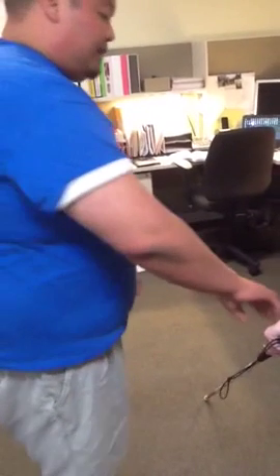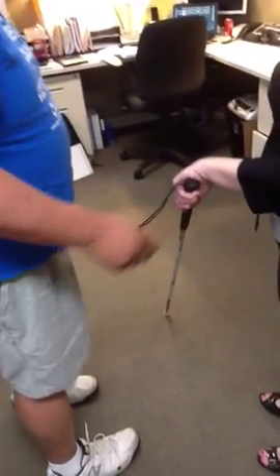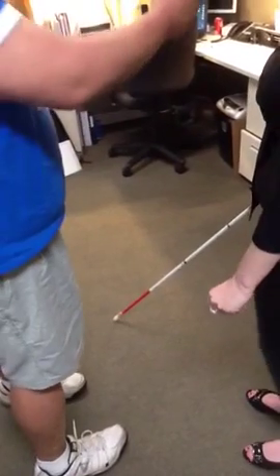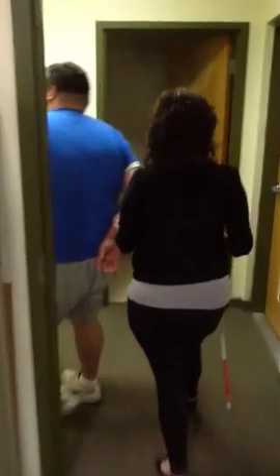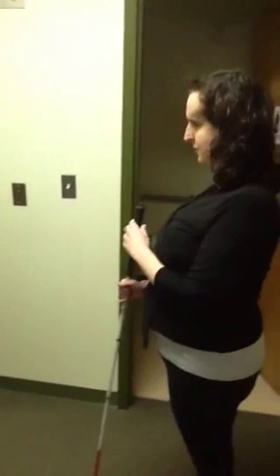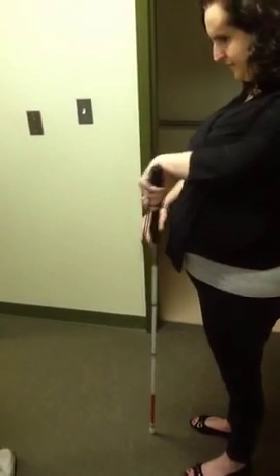Okay? So I'm going to go ahead, if you could hold on to your cane with your other hand, hold it right in the middle of the shaft, like so, it's vertical, like that. This is sighted guide or human guide, and that's how you're going to hold your cane. We're going to go through a narrow space. So go through here. Okay, we're going to step back. Okay, could you give me a diagonal technique with your other hand, please? With the left hand.